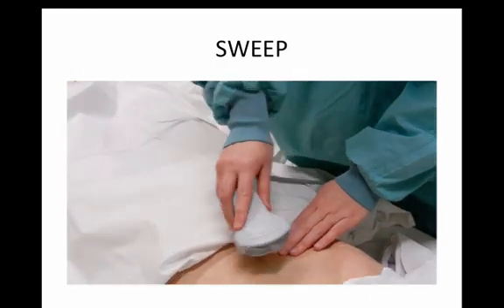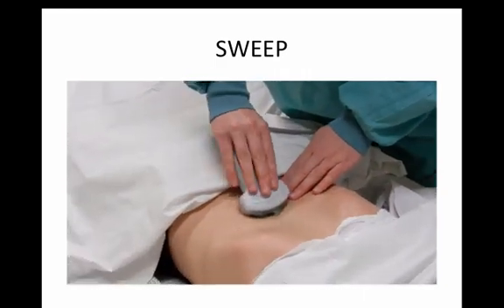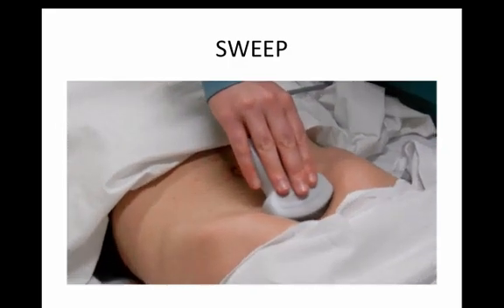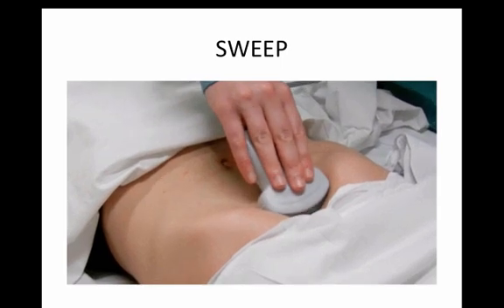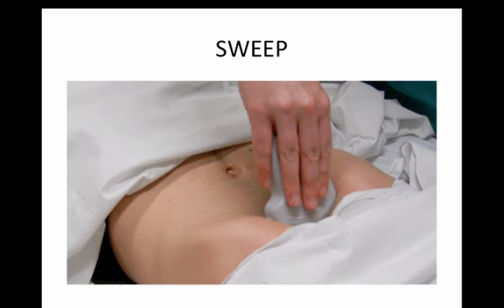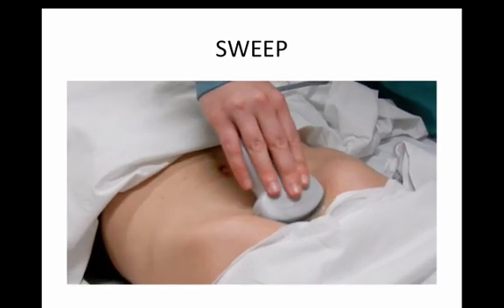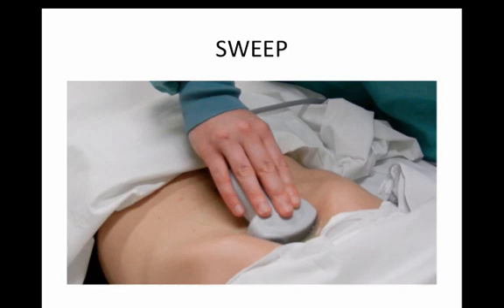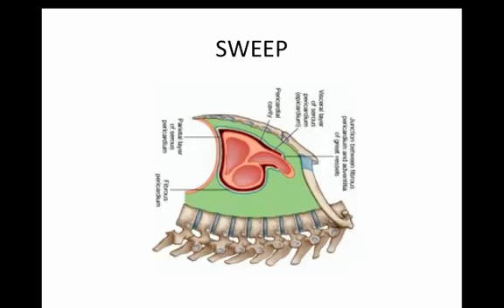Again, the ultrasonographer points out the anatomic landmark and places the probe just superior to that, which is the umbilicus. As she makes her way to the xiphoid, she now completes a sweep, and you can see her hand tilting and tilting back. What is the purpose of this sweep? Well, hopefully this animation will help you understand why we sweep.